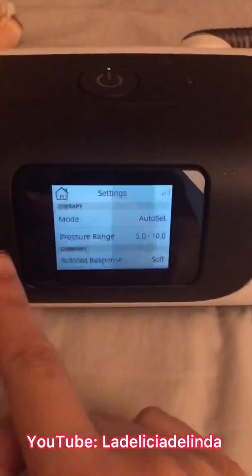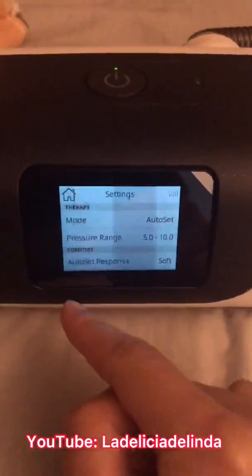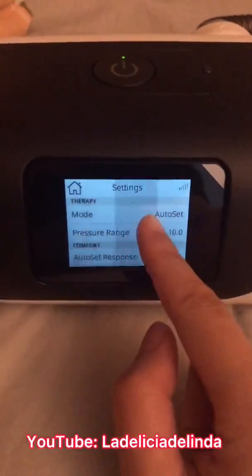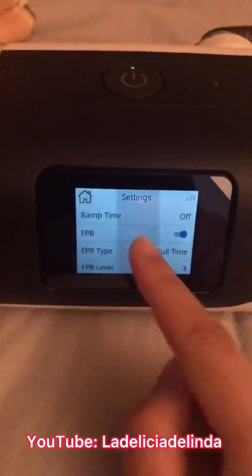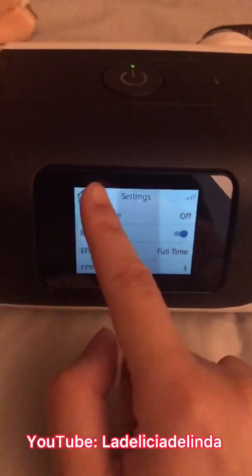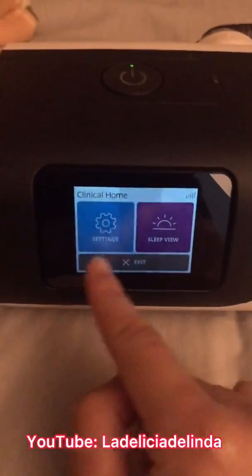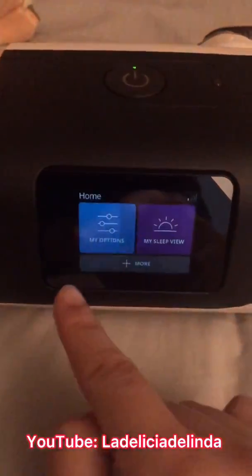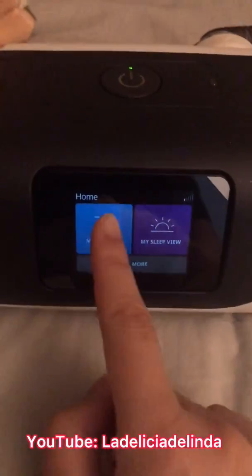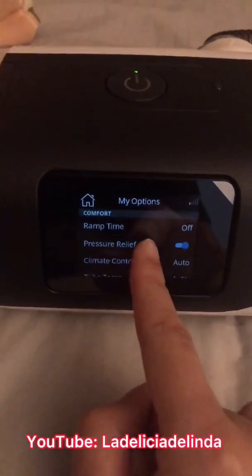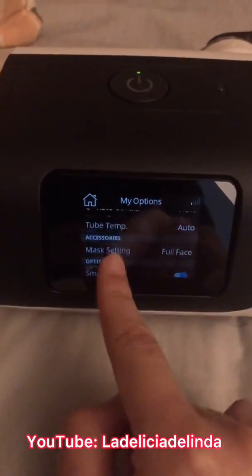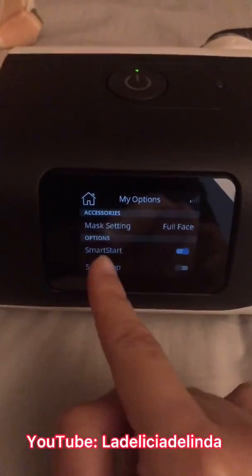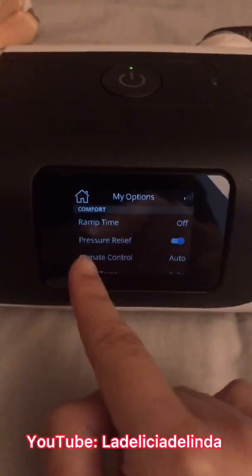So again, two fingers on the touchscreen, hold, and the clinical home pops up. You have the settings here and it's not really that much different on the clinical setting side versus the side the patient usually sees. For the AirSense 11, the comfort settings accessible to you are pretty similar to the clinical settings.